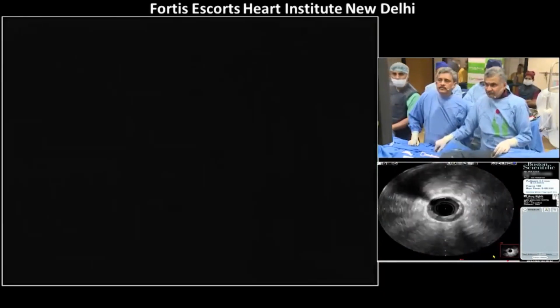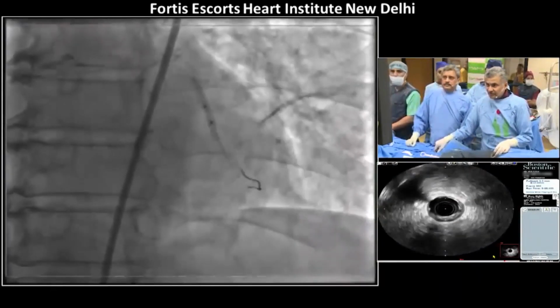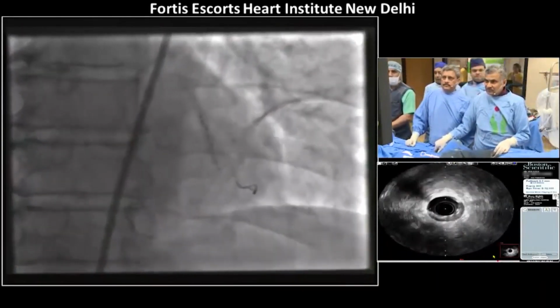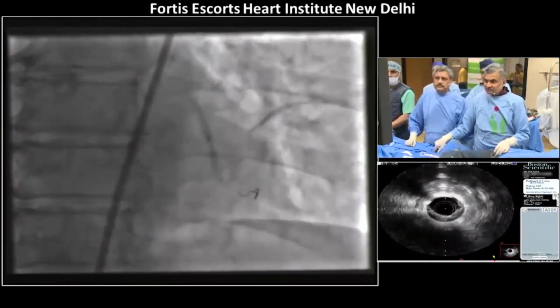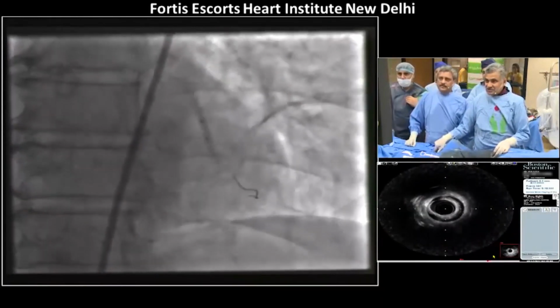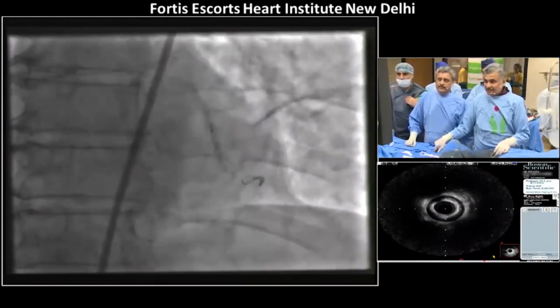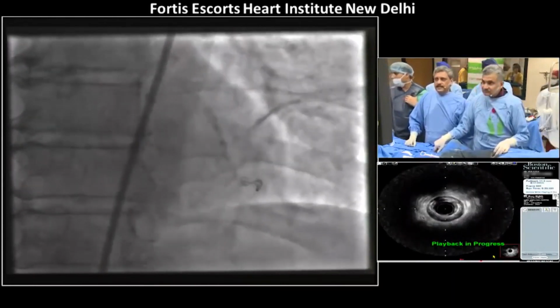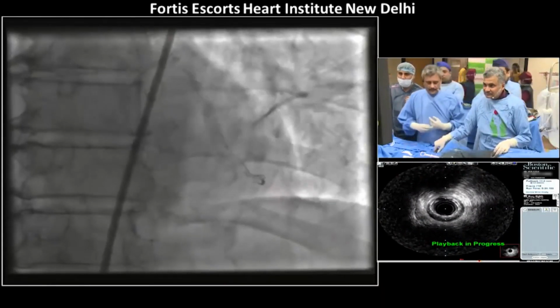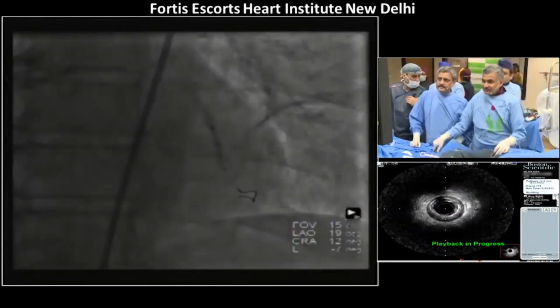It's appearing better, but still the center is not looking all right. Well, you're doing a great job with ischemic conditioning. Yeah. There were some good collaterals from the distal LAD coming to this OM, and the lateral wall was moving, one of the reasons which just prompted us to do this vessel. Yeah. Deflate.